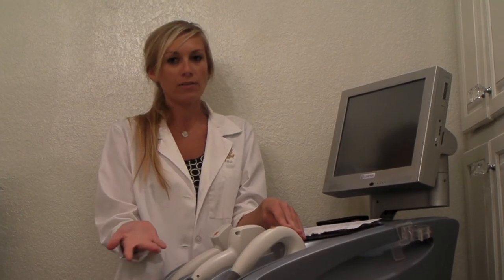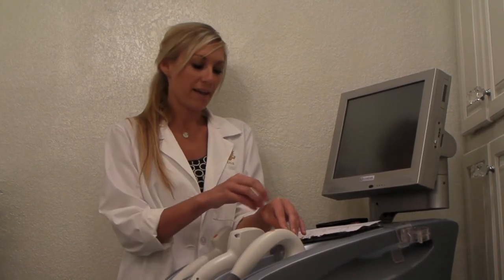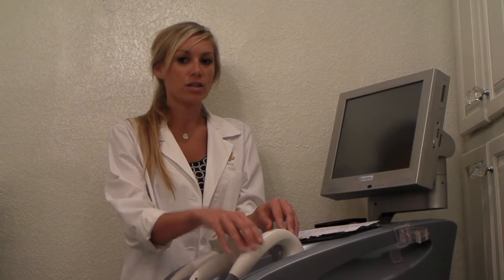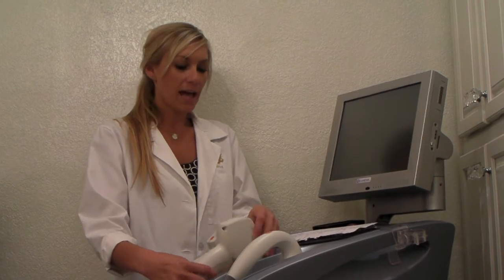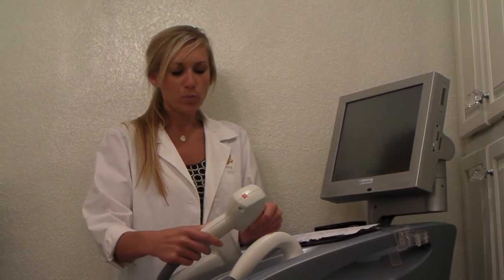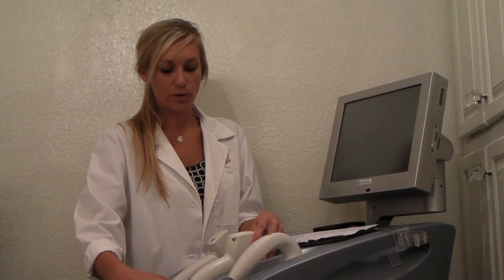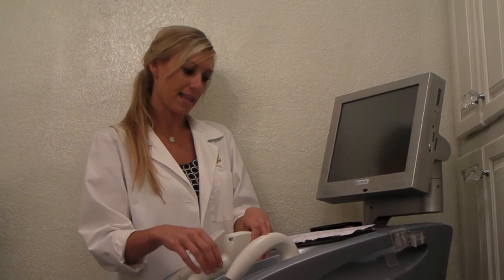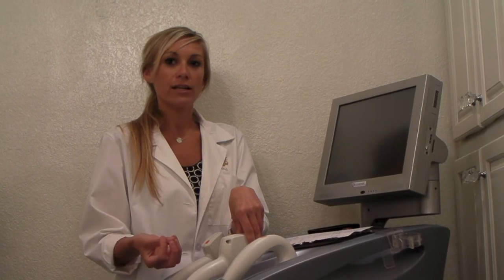And if you pick up on any of those changes in the past 6 months or so, year, and you want to have that lesion taken care of, talking with the physician and explaining the changes that you've seen is very important. The next one is the Lightsheer for the hair removal. Really, the medical benefits for the hair removal mostly have to do with the hormonal changes, imbalances, things like that. It's, again, very important to stay out of the sun, to use sunscreen, and to moisturize. Pain control is the same as the rest, either the topical, ice with the chill tip, or oral medications.